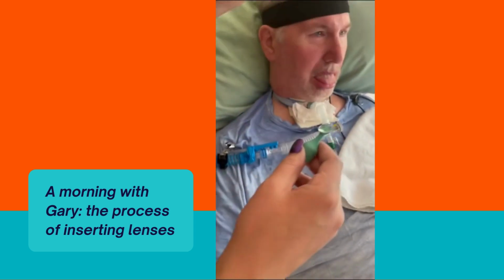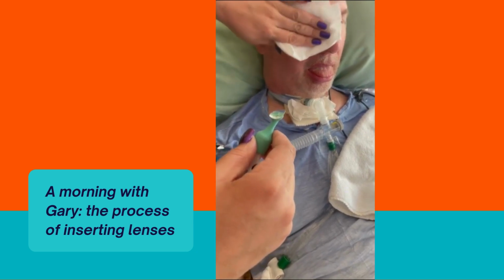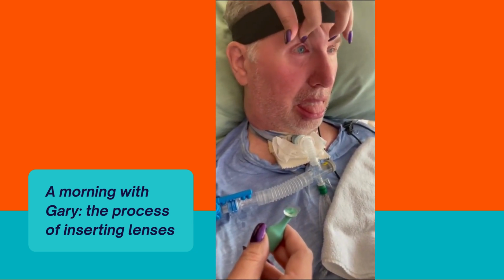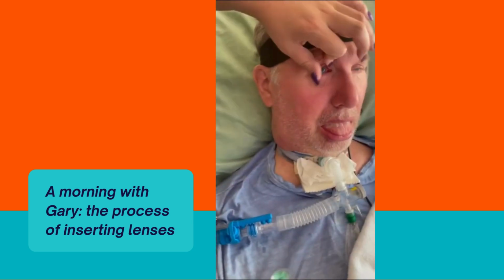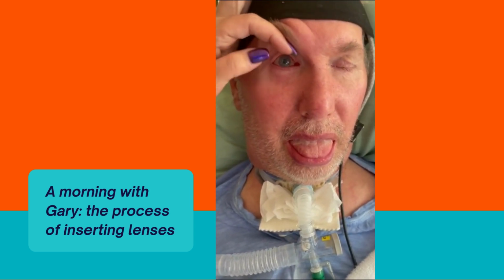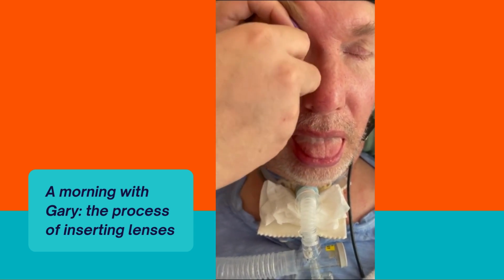Okay, so we're going to go back in on the right side here, and I'm just drying Gary's face. The key for me is always drying off that eye, because your hands have to be able to hold it. If it's moist, it's going to slip. Okay. We're up and we're down. And 1, 2, 3. Up.